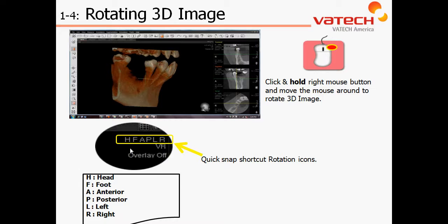We can either use the snap views as indicated in the upper right-hand corner of the pane within our 3D rendering, such as H for head, F for foot, A for anterior, P for posterior, L for left, and R for right. We also have the ability to hold down the right-hand side of our mouse and move the 3D image simultaneously.